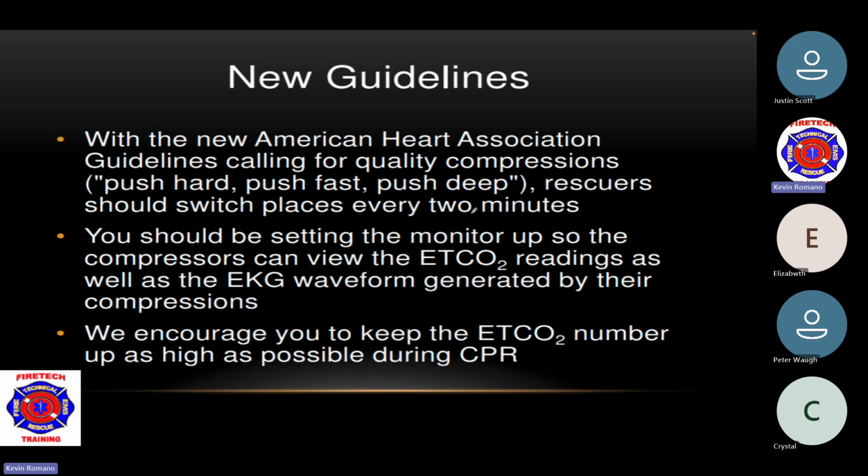So with the new American Heart Association guidelines calling for quality compressions, push hard, push fast, push deep, rescuers will switch places every 2 minutes. You've hit that pretty hard in CPR classes, team-focused CPR, rotating out. You should be setting the monitor up so that the compressors can view end tidal CO2 readings as well as the EKG waveform generated by their compression, right?